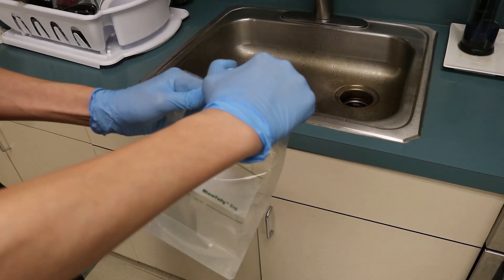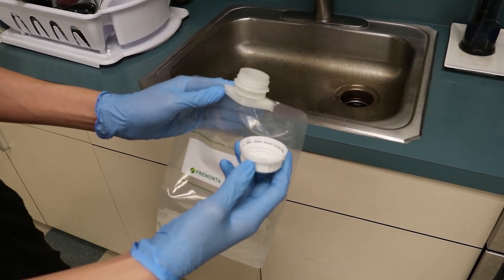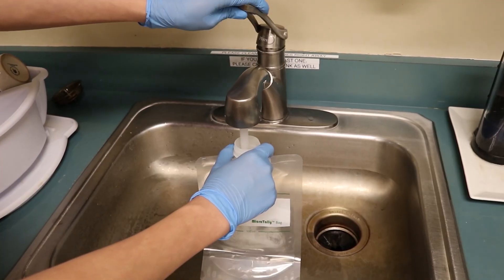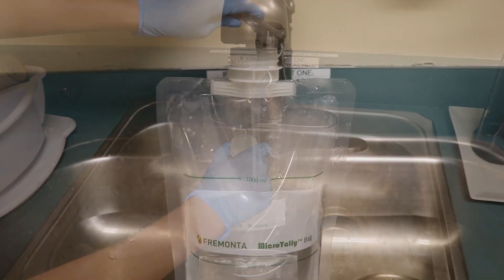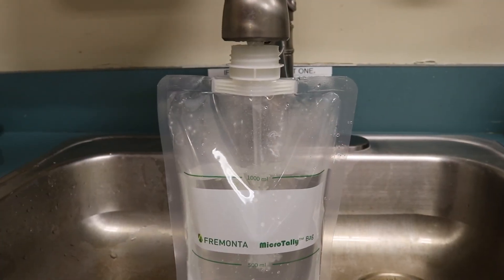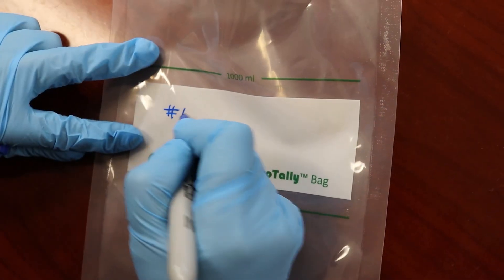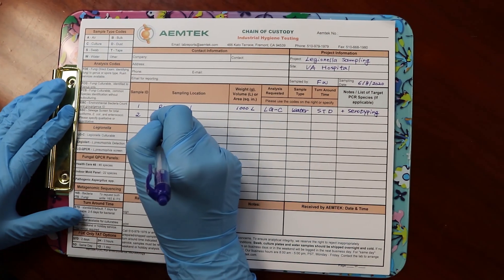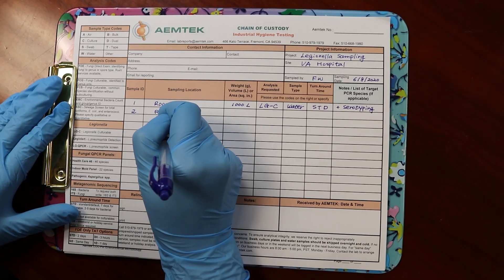When sampling, open the cap of the 1 liter bag and bring it under the water source. Turn on the water and fill the bag to the 1 liter mark. Label the liquid bag with a unique ID and record the type and location of the sample on the COC form.